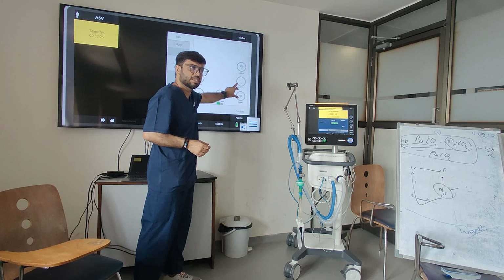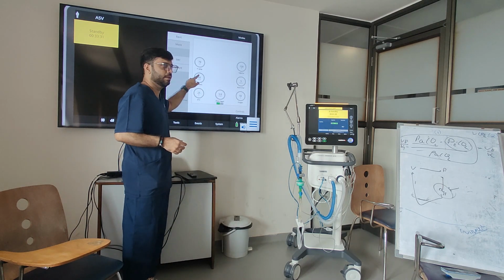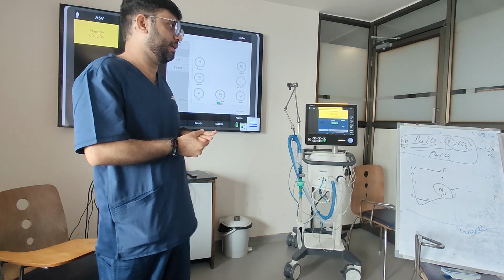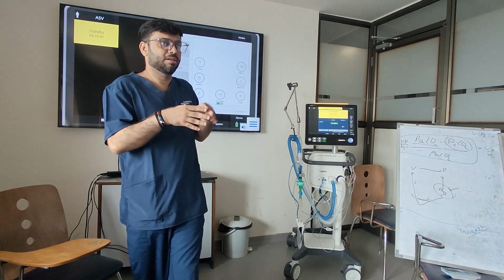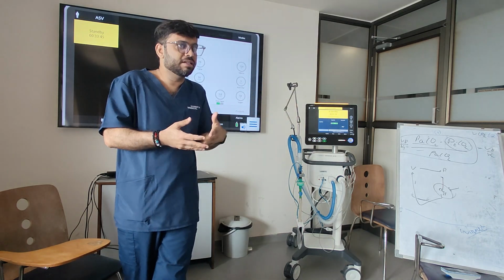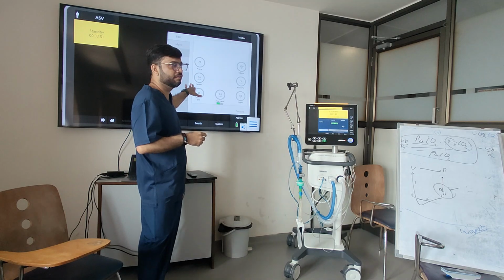Now this is important. This PEEP and FiO2 remain the same as in other conventional modes. You can set them as per your patient's oxygenation. The important part is the ASV limit. It is your upper pressure limit to avoid lung injuries. The default setting is 30, and ideally we also always want to maintain the pressure below 30. But in case you have ARDS patients, where we know there will be higher pressure expectations, you can increase it to 35, 40.